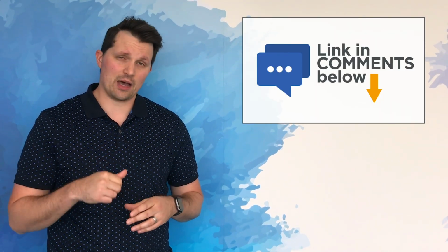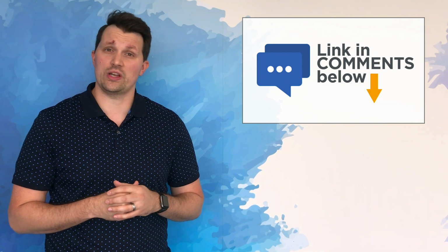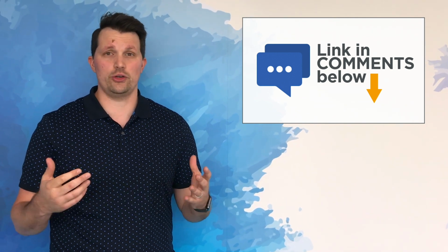All right, now that we've looked at the new process, you may be asking, well, Justin, I either purchased equipment from Dentsply Sirona and never registered for inLab Software 16 or inLab Software 18 for that matter. So how do I get involved with this new process? It's simple. I'm going to post a registration link right in the comments section below where you can go and register. That'll get you added into the brand new process.